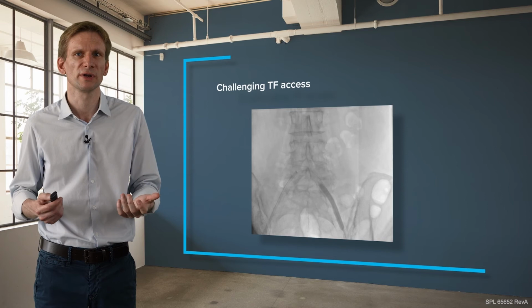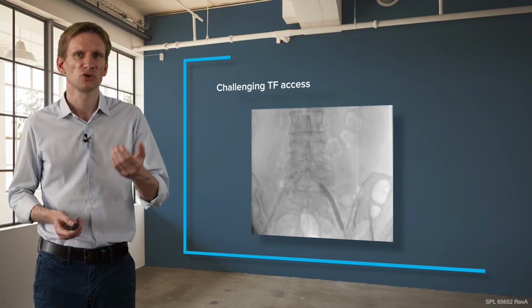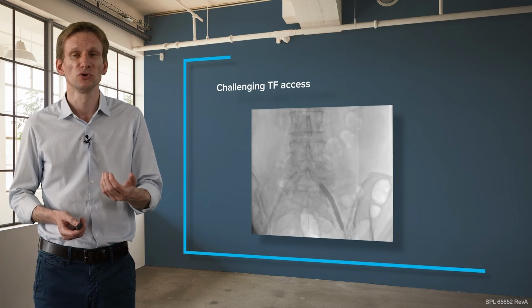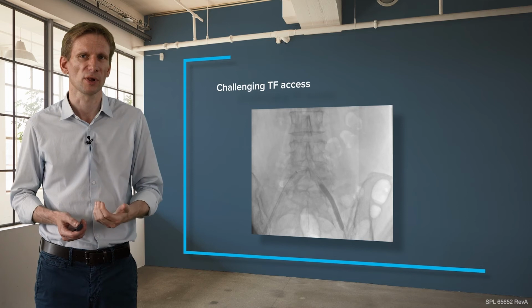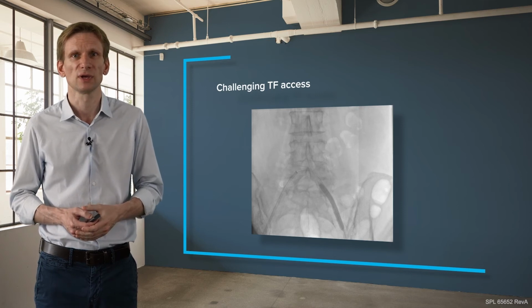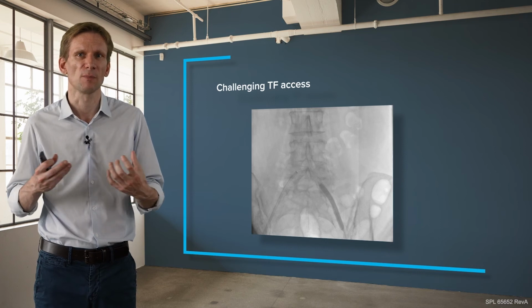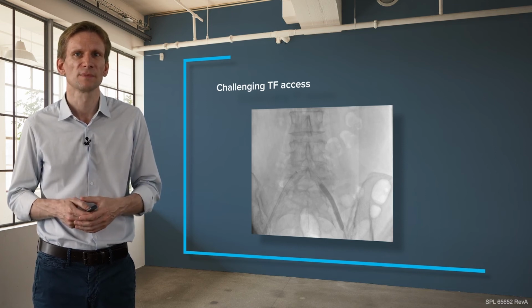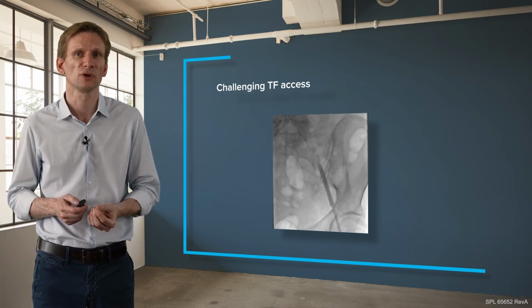You have the luxury of having this balloon which has 300 pulses, so you can just maximize the use of this balloon by treating almost the entire iliofemoral axis, and that's also what I do to get the maximal out of this treatment and to have the maximal compliance of your vessel when having to cross. So here this is even all the way up to the common femoral artery.